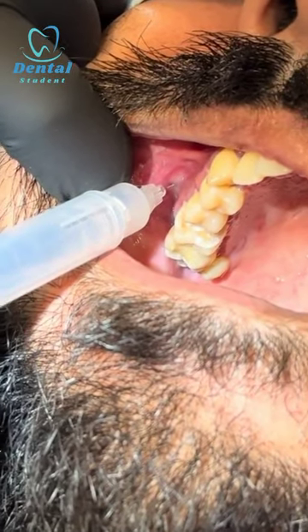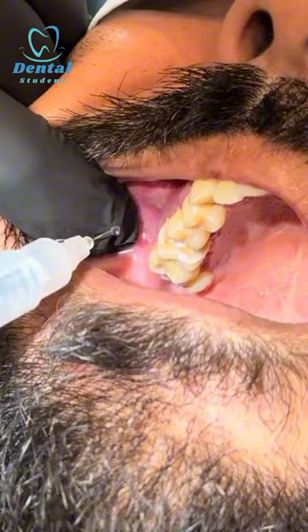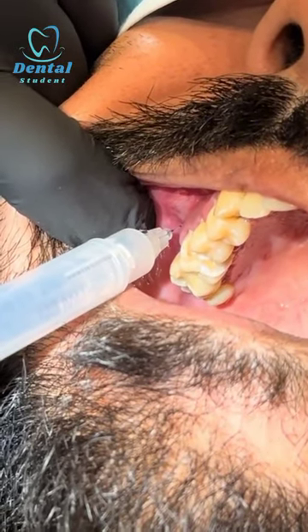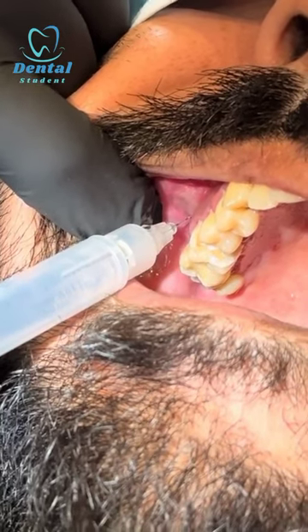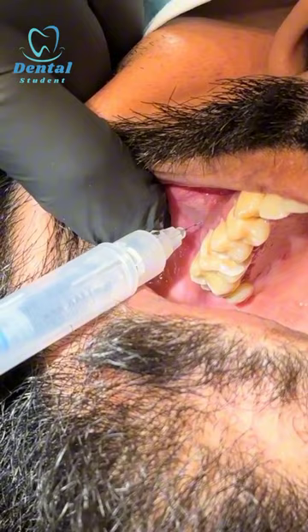Well done. Next, the tooth to be extracted. I'm going to do the same for the seven. Another sharp scratch — you're doing fantastic. So that's for the posterior superior alveolar nerve, 45 degrees to the root of the tooth.